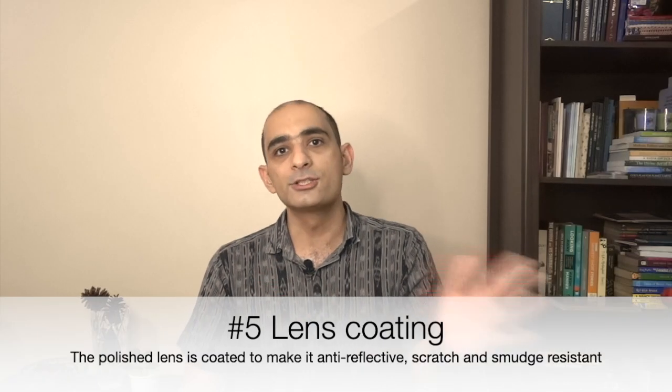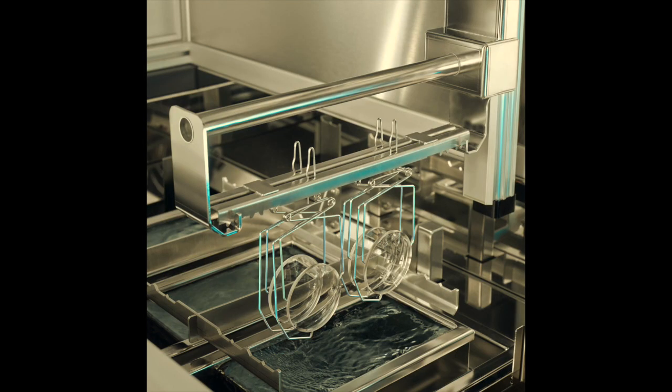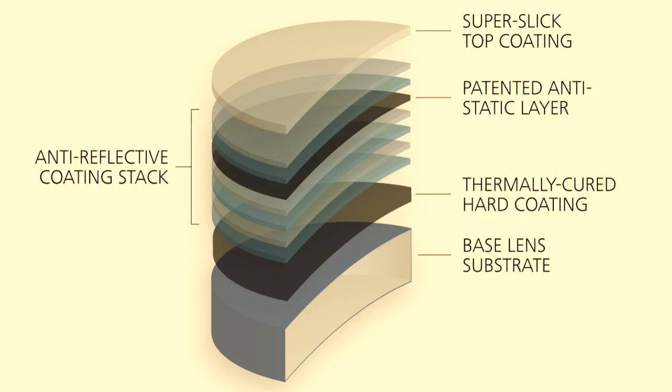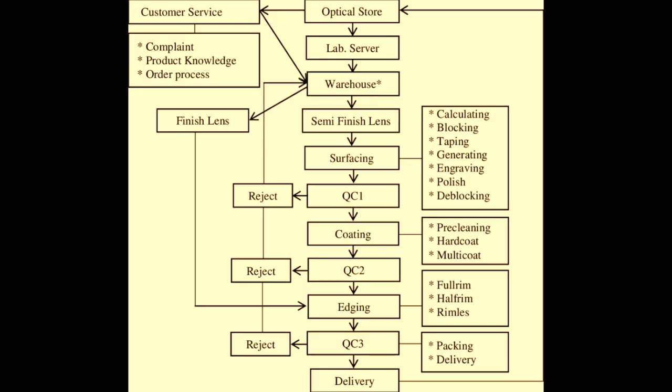Lens coating. Digital progressive lenses can also be coated with various types of coatings to improve their durability, scratch resistance and anti-reflective properties. Quality control. Finally, the lenses are subjected to rigorous quality control checks to ensure that they meet the required standards and specifications.